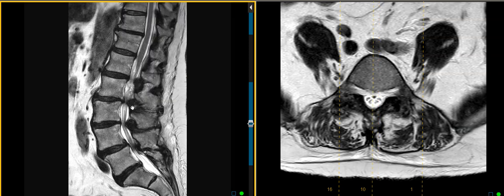So again, this is an elderly patient, 83 years old, and they don't have a big compressive disc herniation, but they do have a small disc bulge or protrusion here between L2 and L3. This is the disc. There's a little bulging disc. And in the back here, we see this mound of darkness. This is the ligamentum flavum. They have a thickening of that, and that's poking out from the back.